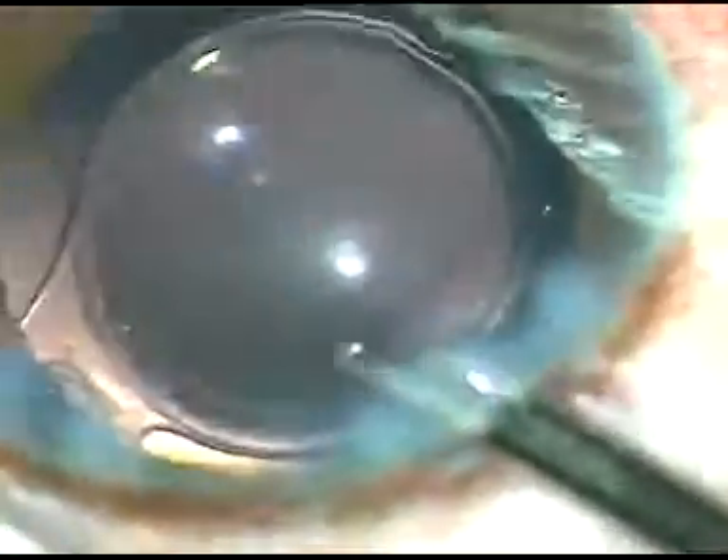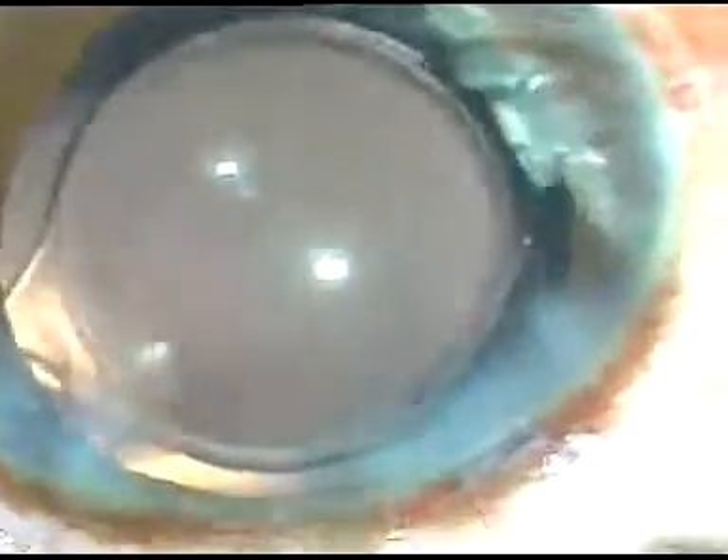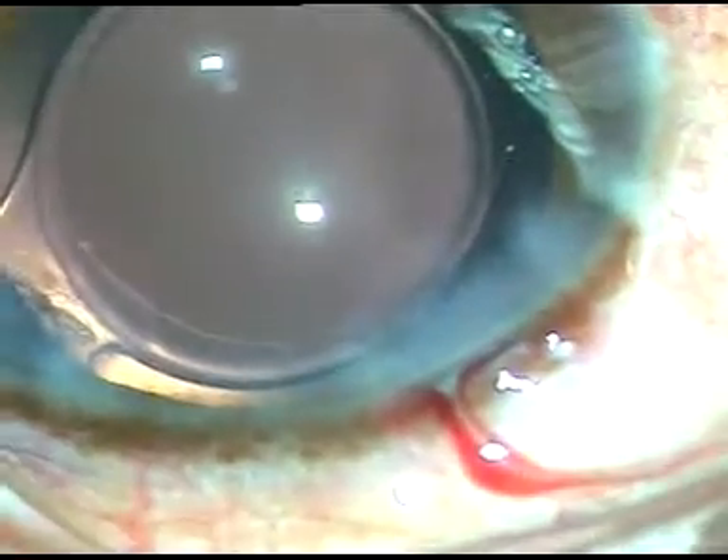Under higher magnification I check if there is any cotton fiber or particulate matter left in the anterior chamber. I form the anterior chamber and conclude the case. Hope this video will help you in your practice.